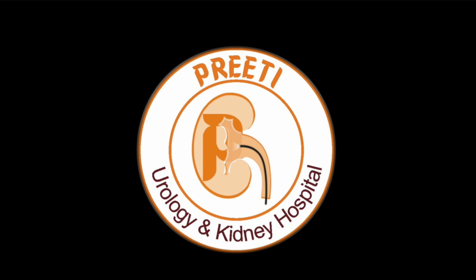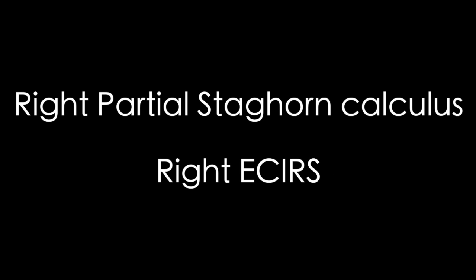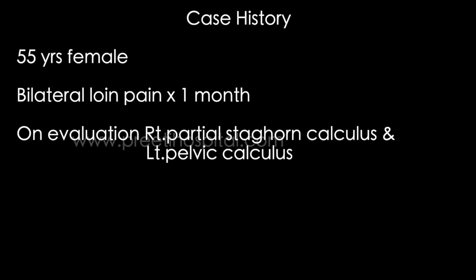Here is a case of right partial Staghorn calculus, right ECIRS. A 55-year-old female patient with bilateral loin pain for 1 month. On evaluation, bilateral stones, right partial Staghorn and left pelvic calculus.